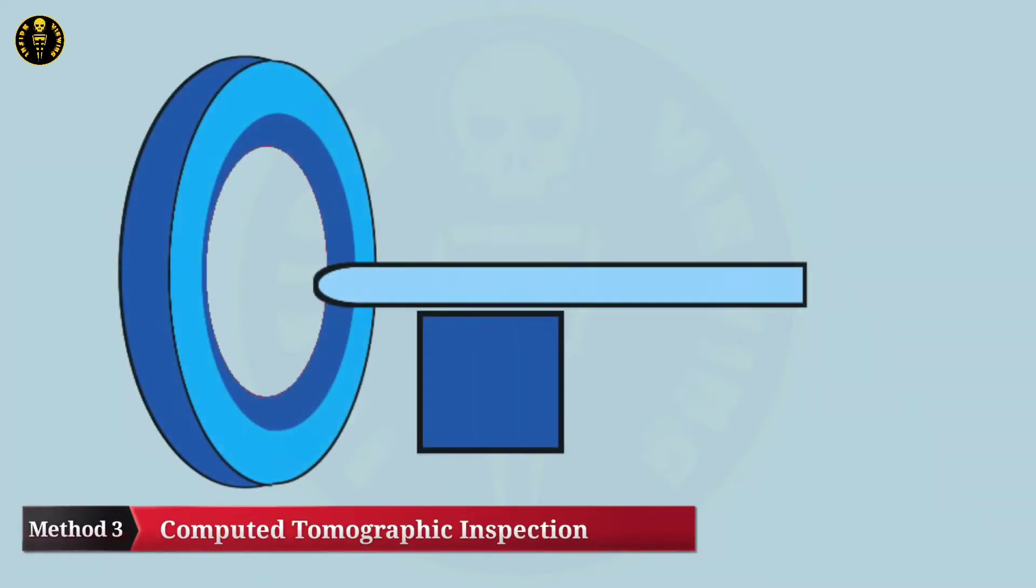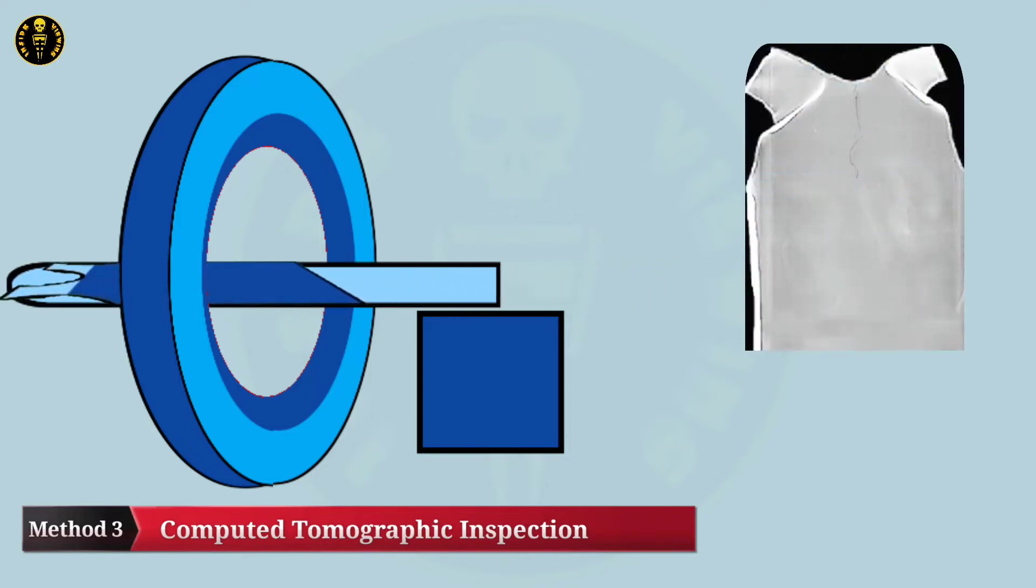For this method, place the apron on the patient's couch, then take a topogram of the apron. From the topogram you can easily identify or detect any imperfections in the lead lining.